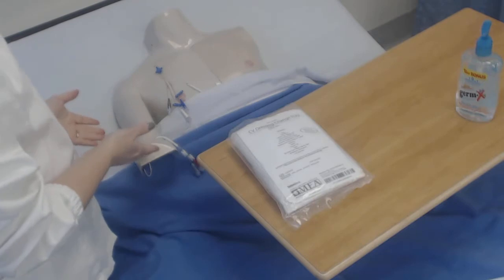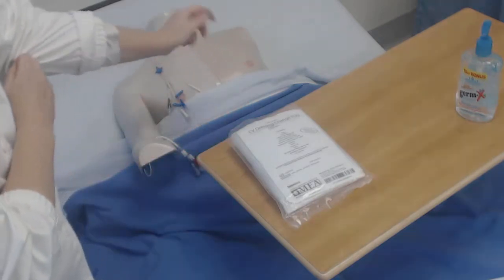I have washed my hands, identified the patient, provided privacy, and explained the procedure.